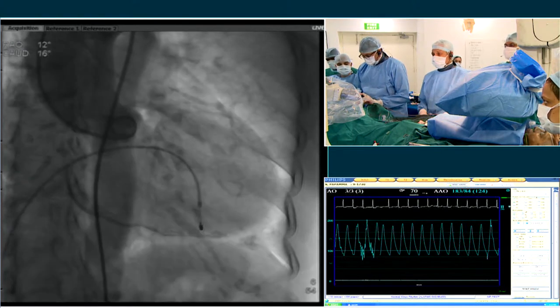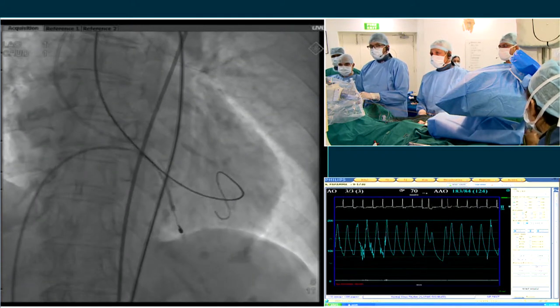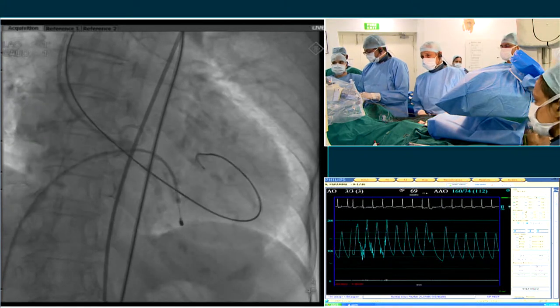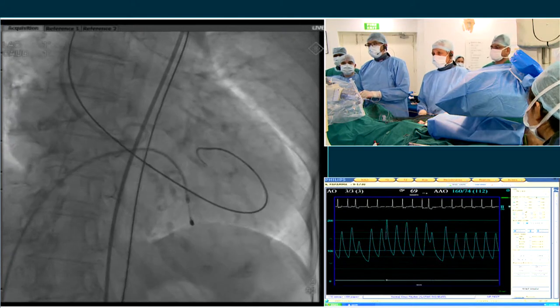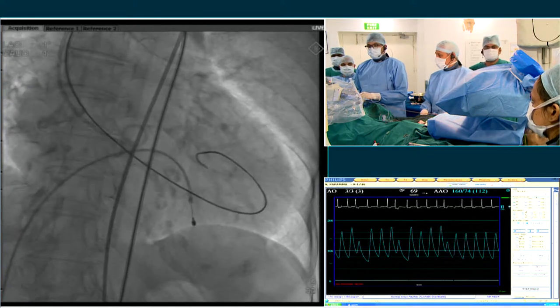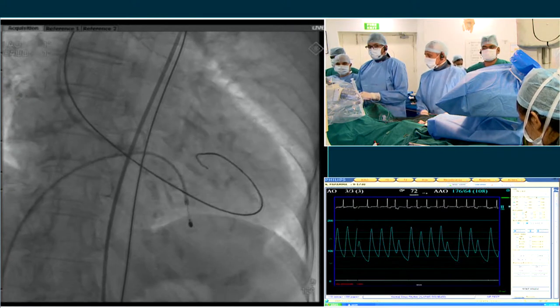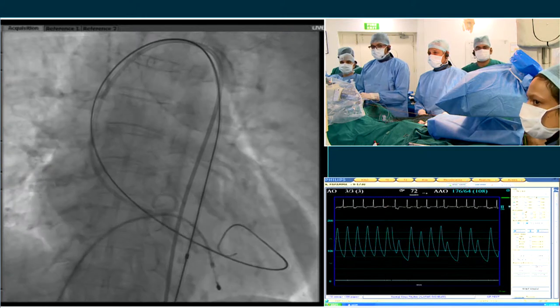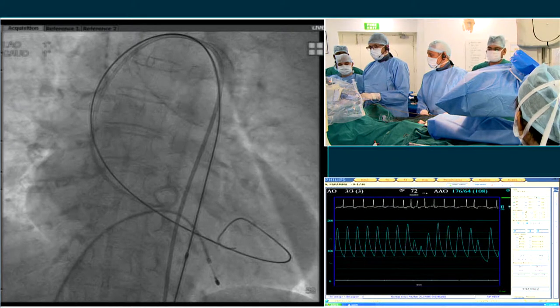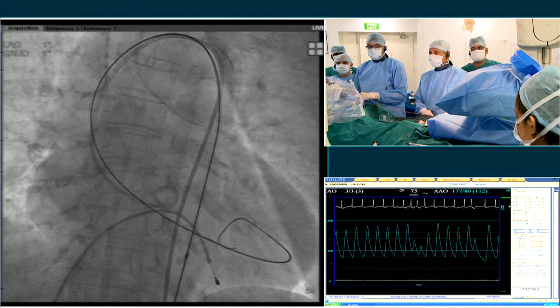In general, with all bicuspids, I pre-dilate. We cross the valve here with the Terumo. Next slide. And we got our Amplatz extra stiff wire in position. We have a 16 millimeter balloon. My valve comes with either a 16 or a 20. I think 20 would be too aggressive here. Ideally, we'd do an 18, but we have a 16 here, and they're working on more sizes as well. So we're going to go ahead and pre-dilate. We put the Python sheath up and use an 18 French dilator to expand. The Python goes in small, but has some seams that expand as the valve goes in, so we put a dilator to expand that to make it easier.